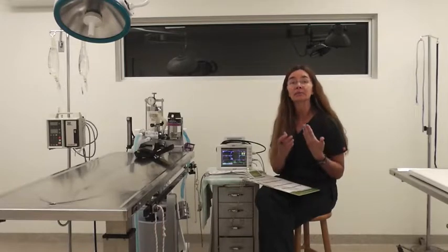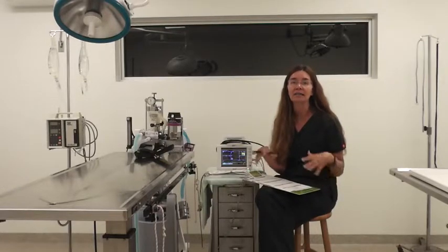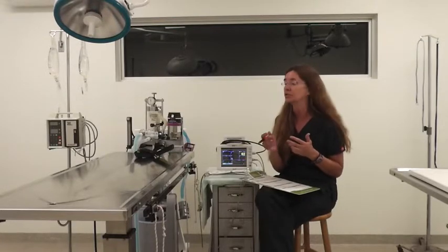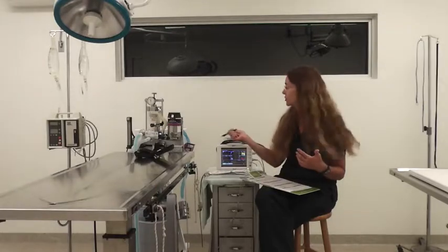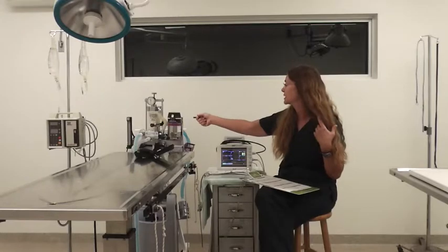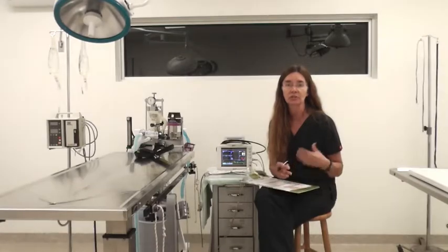If the patient isn't breathing and they're not getting enough O2, which means they're not getting enough oxygenated blood to all the different tissues in their body, this can affect the nervous system or nervous function. This can result in death if the respirations are compromised in any way, such as an airway block. So you can watch how a patient is breathing. You can watch their chest rise and fall. You can watch the reservoir bag also, or the intake and exhale on the machine, to make sure that they're breathing.